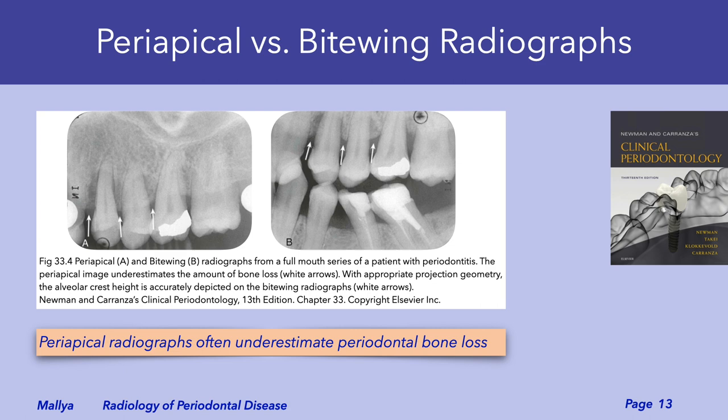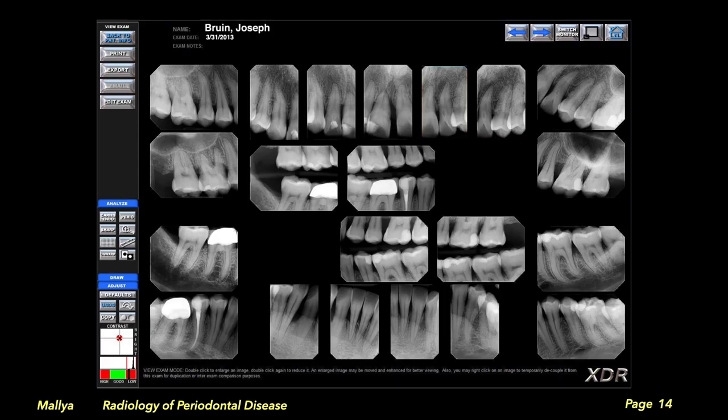Periapical radiographs often underestimate the amount of periodontal bone loss. A full mouth radiographic series with periapical radiographs and bitewing radiographs that are properly exposed and positioned will provide adequate information to assess periodontal bone levels.